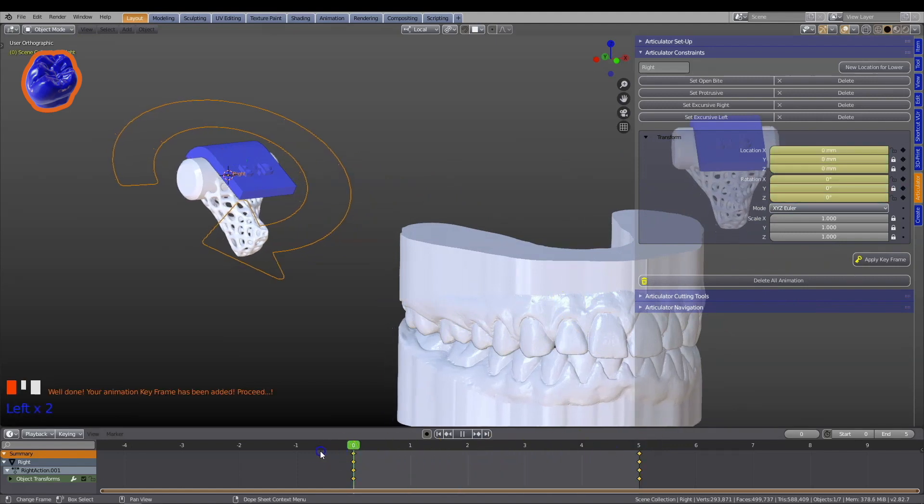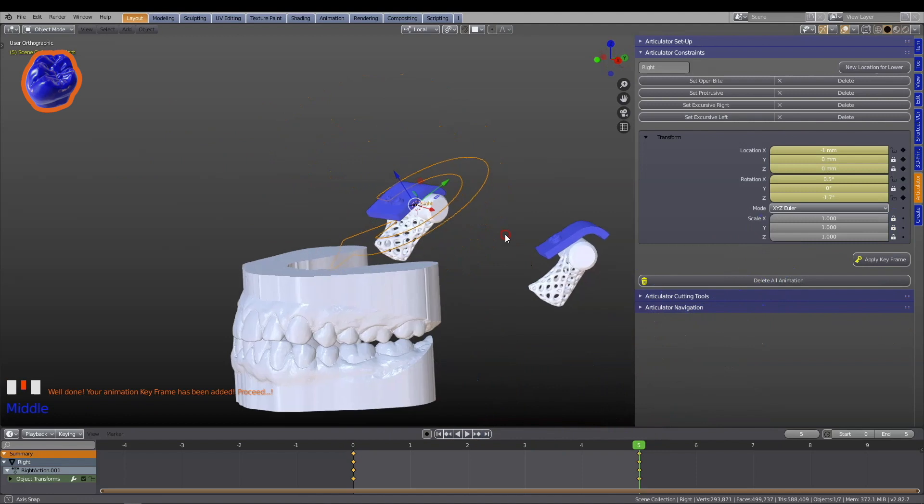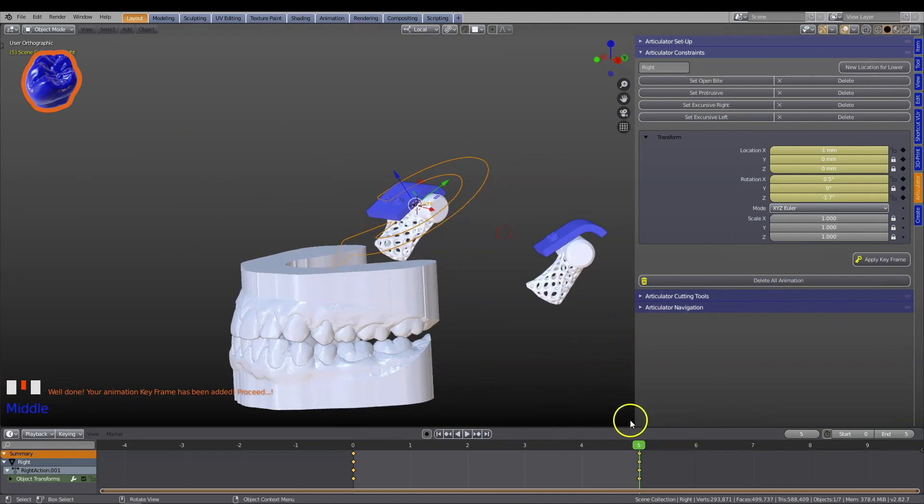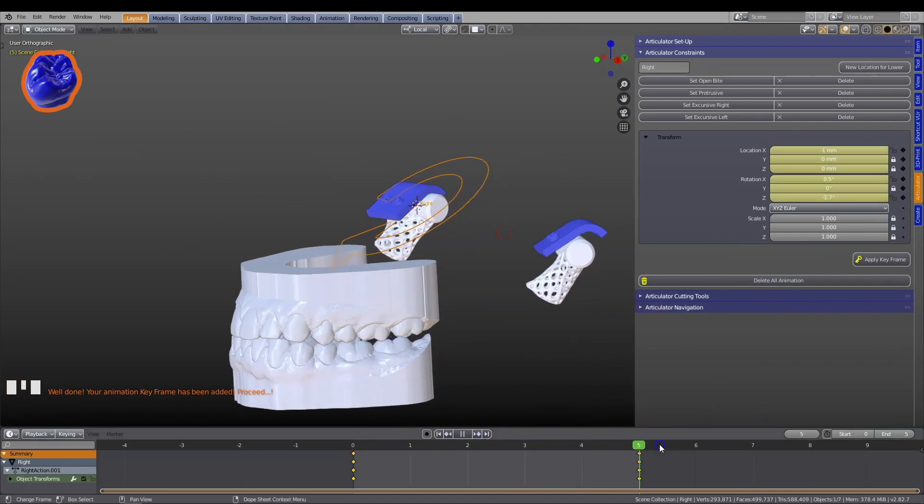Keyframes can be set in Blender's timeline to complement all articulator movements, according to your own condyle settings.